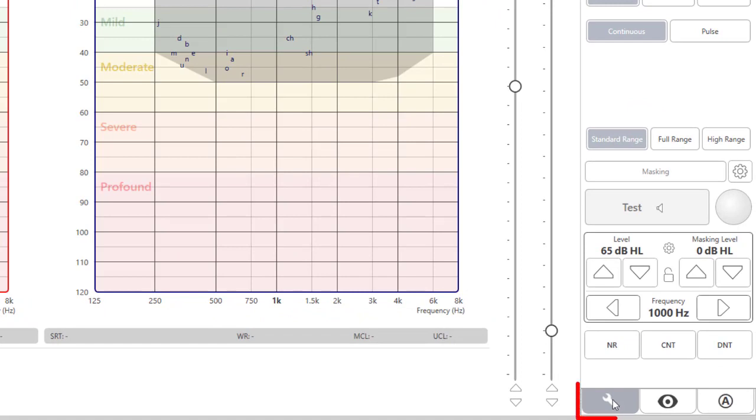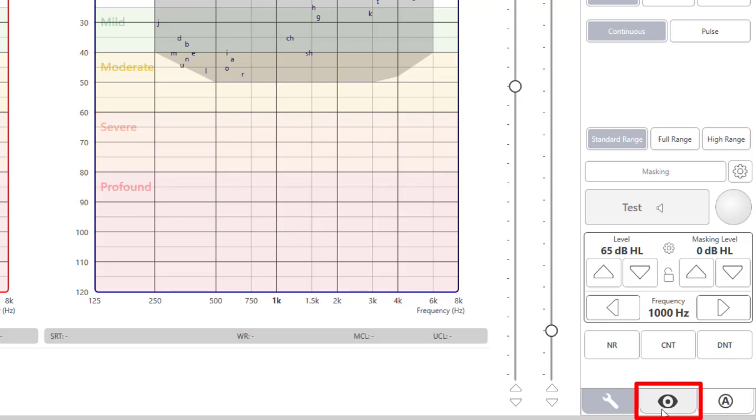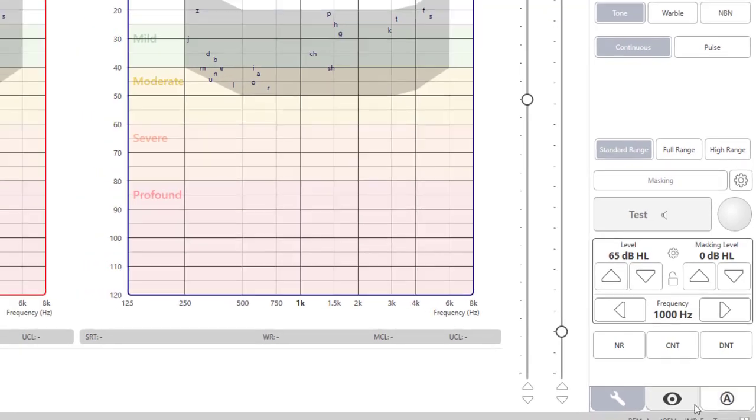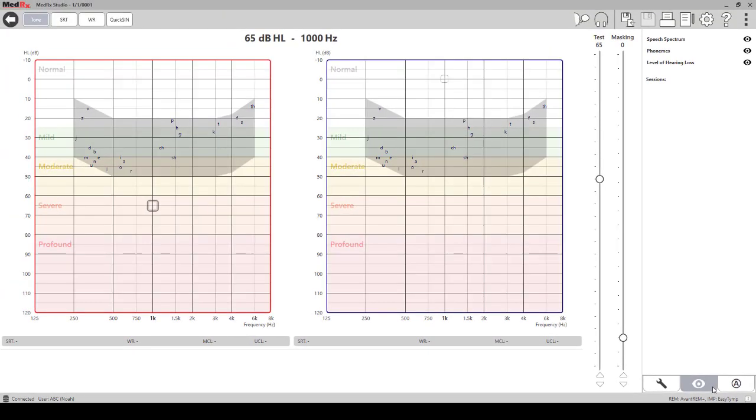At the bottom of the audiometry panel screen, you will find the tools icon. This is your start screen by default. Next you will find the view icon and the automated audiometry icon. The view icon will allow you to choose to display or hide the speech spectrum, phonemes, the level of hearing loss, and see the patient's sessions.